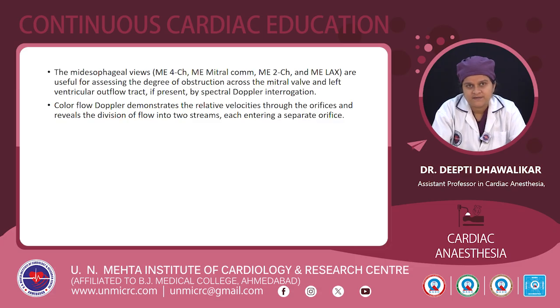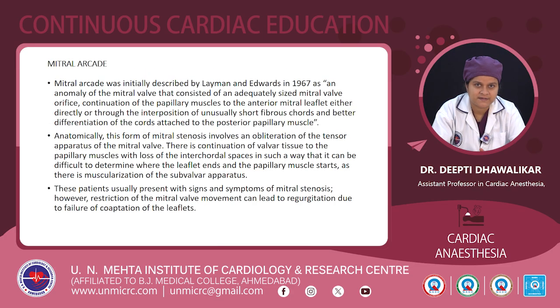The midesophageal views are used basically for assessing the degree of obstruction across the mitral valve and left ventricular outflow tract, if present, by spectral Doppler interrogation. Color flow Doppler demonstrates the relative velocities through orifices and reveals the division of flow into 2 streams entering separate orifices. Now coming to mitral arcade.